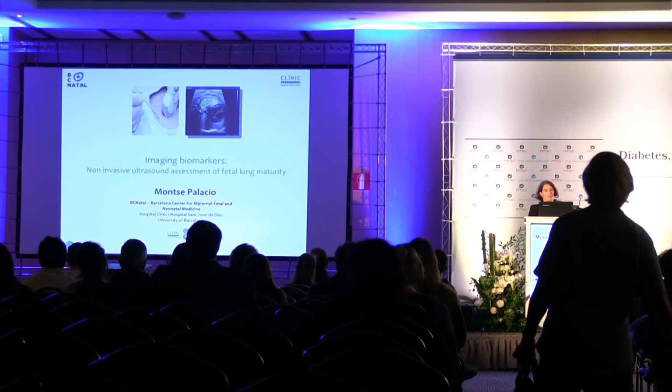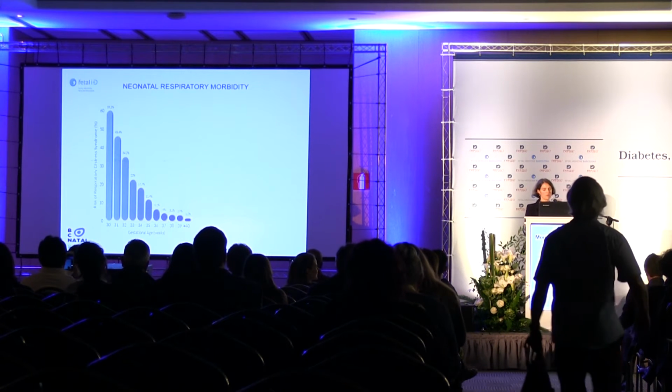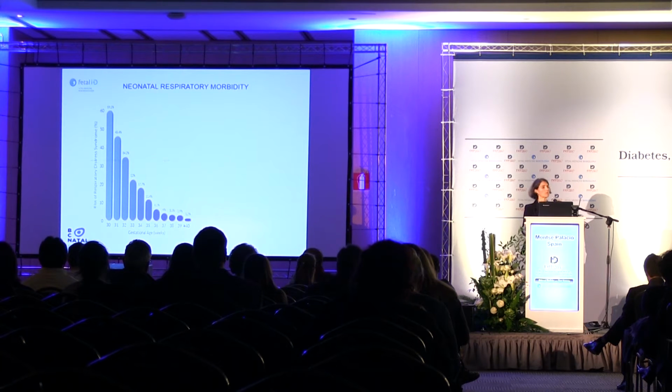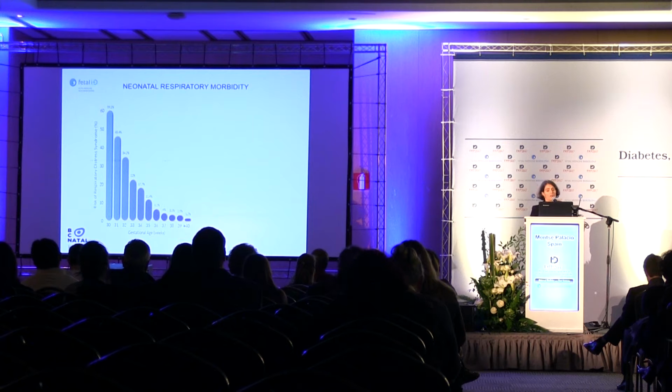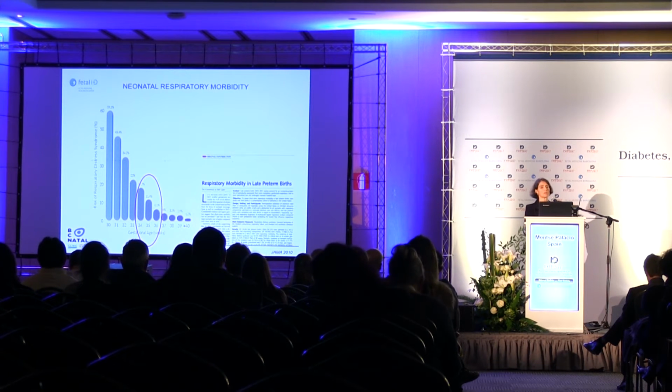So why do we need assessment on fetal lung maturity? Well, we need assessment because we know that preterm babies have danger of neonatal respiratory morbidity. We know for sure in very early or very late weeks that they are at very high risk or very low risk, but we have a gray zone in the middle where the risk is still high, but not that relevant.